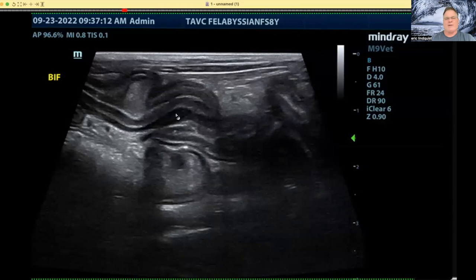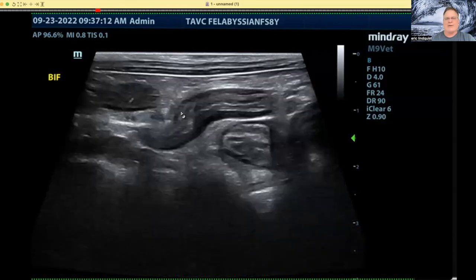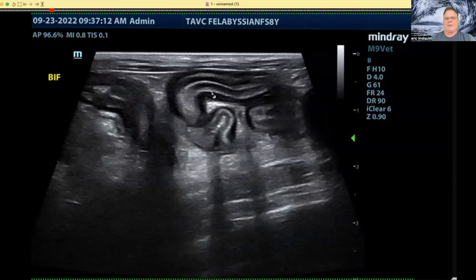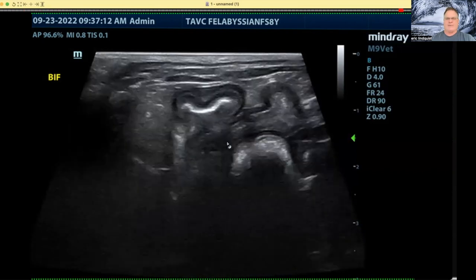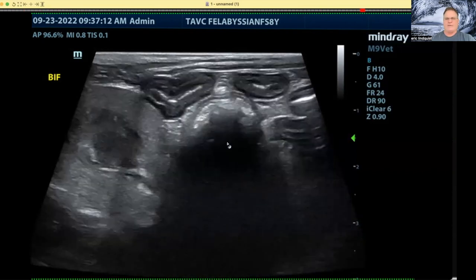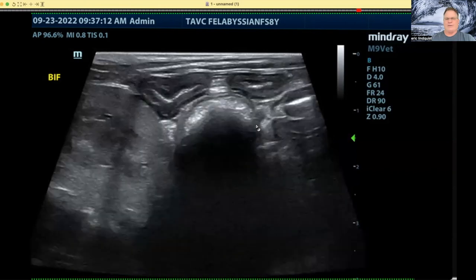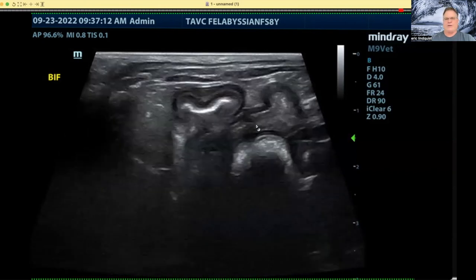It also depends on where you take your histopath — guided by intraoperative ultrasound, you may have a more dramatic result from an area that's a little bit thicker. What I'm looking at in these intestinal tracts is whether that submucosal layer gets disrupted. It's really in good shape all the way around. We also have typical mesenteric lymph nodes that are enlarged. This is the cecum — the dirty shadow of the cecum — and if you want to follow the ileocecal, you look for that dirty shadow until the ileum comes in.